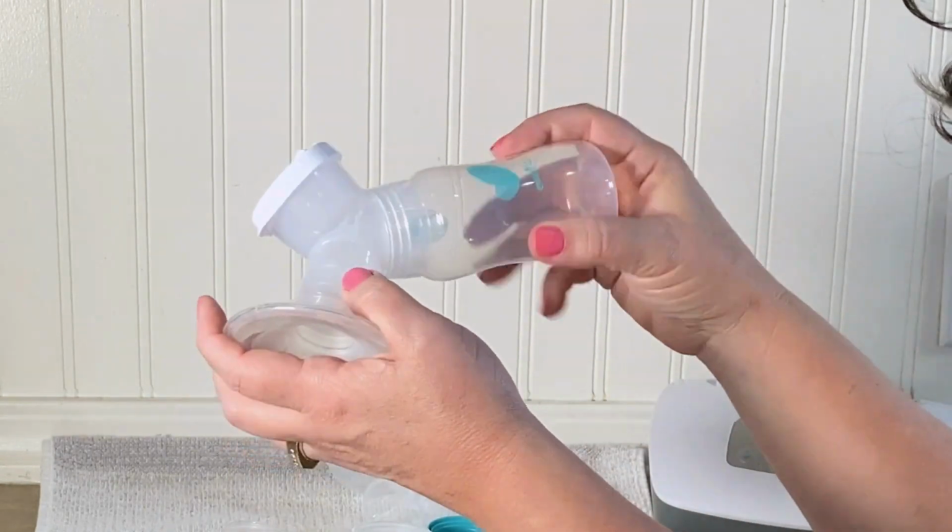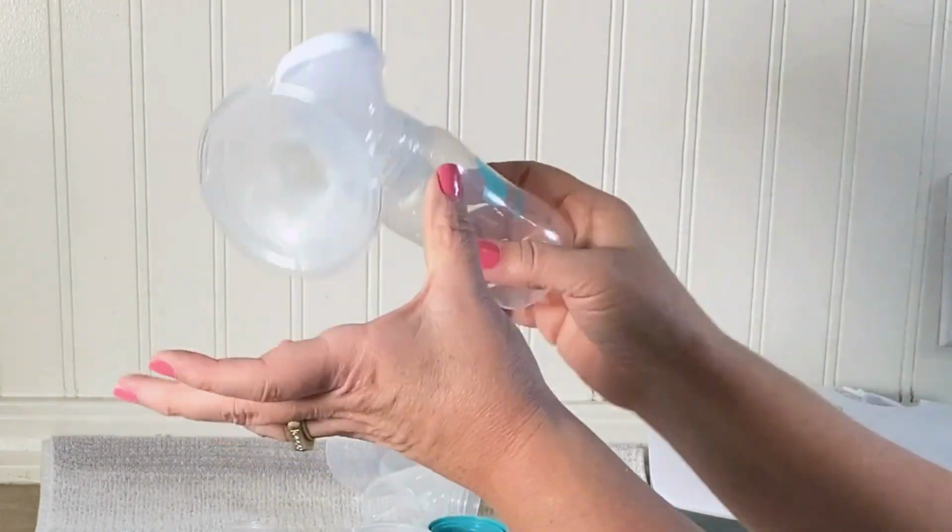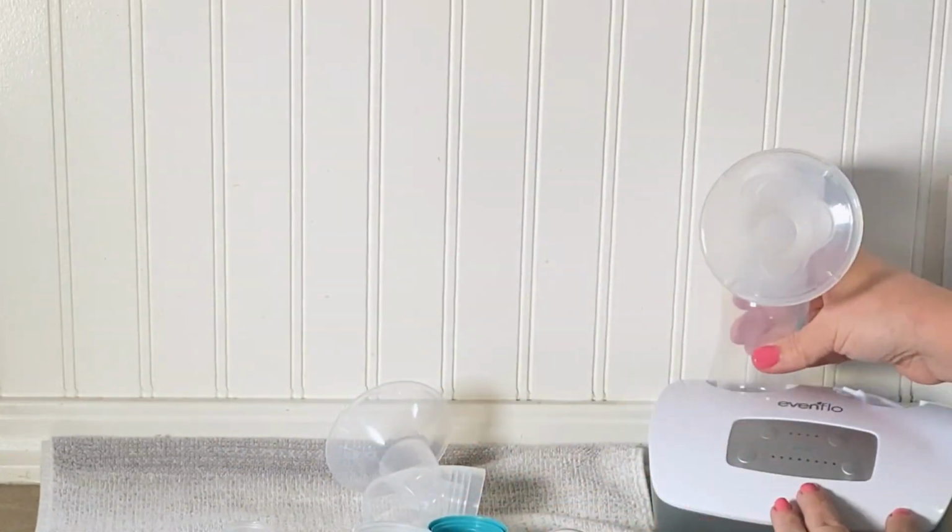Okay, lastly, we'll attach a bottle. There we go, that's the first one. Now we'll do the second one.